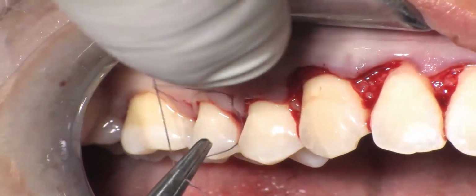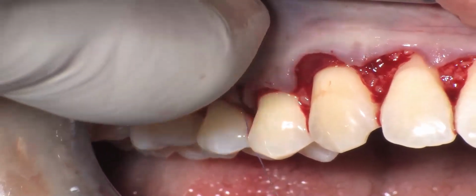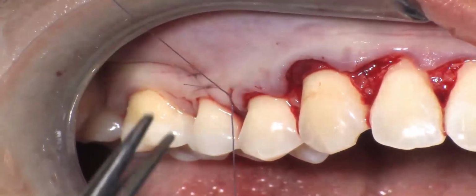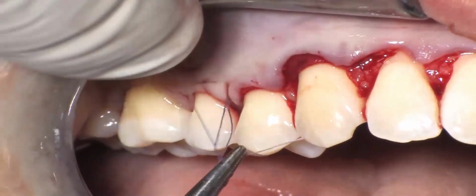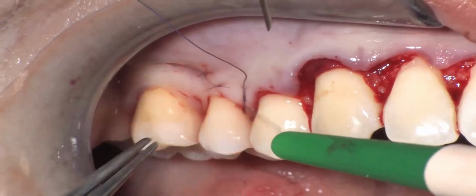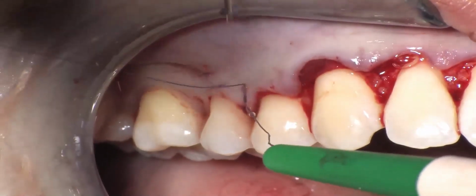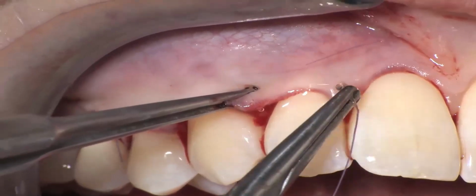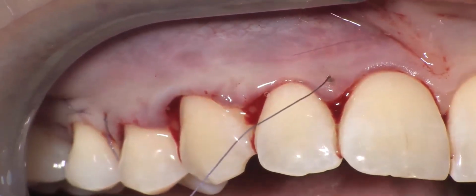And once the papilla is in the right position, I can close the knot. By physiologic. That the papilla between the central and the lateral is in the right position.